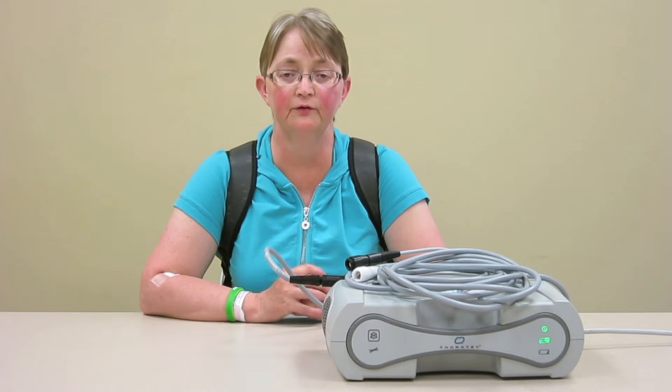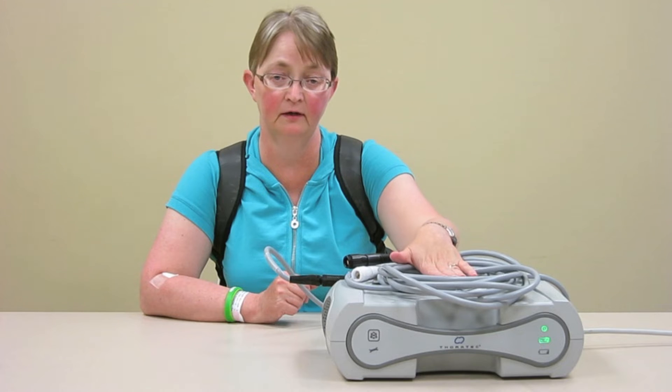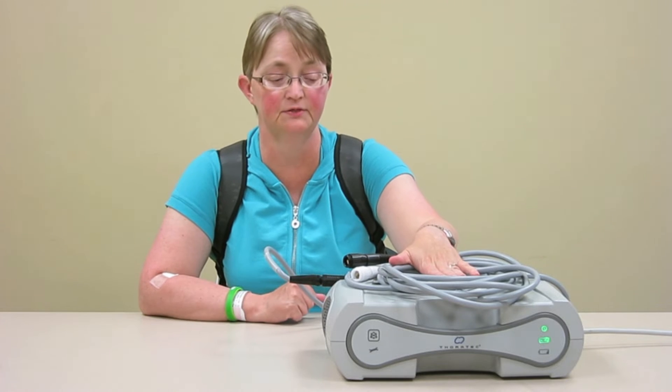One of the other pieces of hardware that you get when you go home with your LVAD is a power module. I put mine on my bedside stand — it sits there permanently.